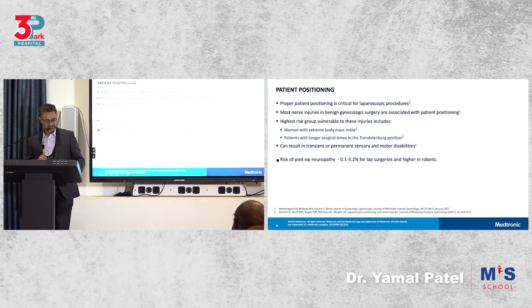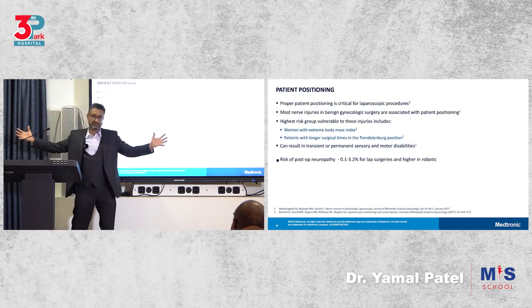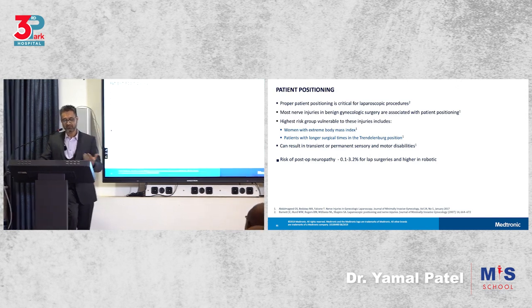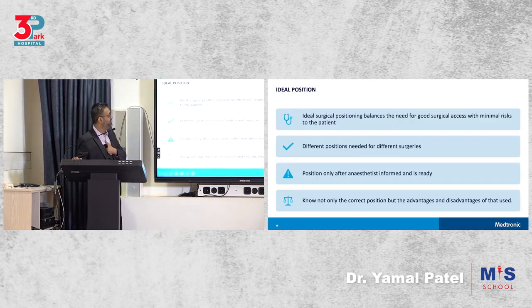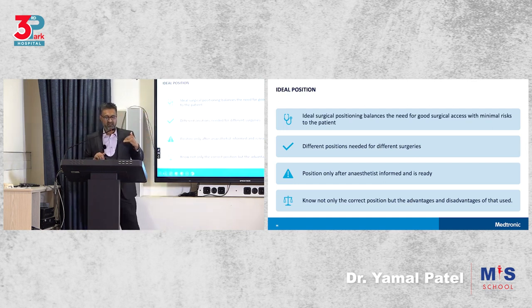Positioning, you must have discussed positioning, and I think this is probably among the last few topics, but this is what we have covered in basics, I believe. So positioning is very critical for patient. You don't want injuries, and many of them, if positioned badly, will cause nerve injuries, etc. So what is an ideal position? It's the position that is ideal surgical positioning, balancing good access with minimal risk. So you don't want to injure the patient, but you want to make sure you see better when operating.